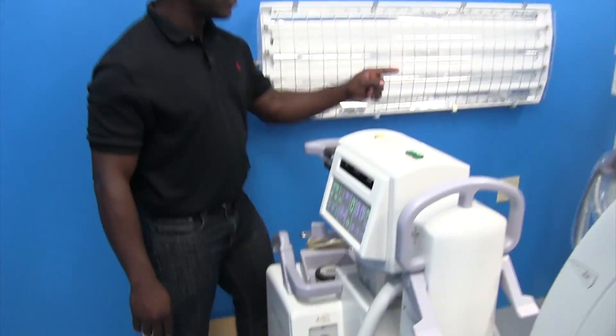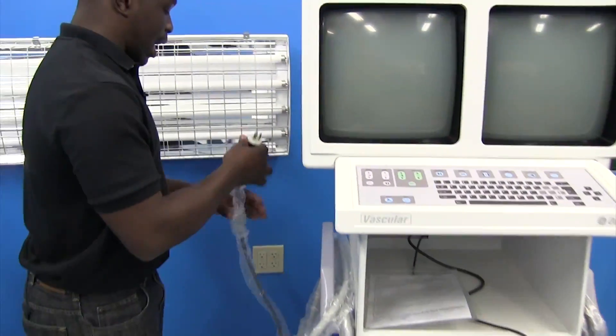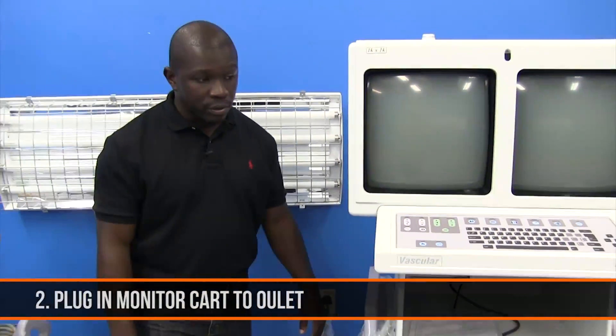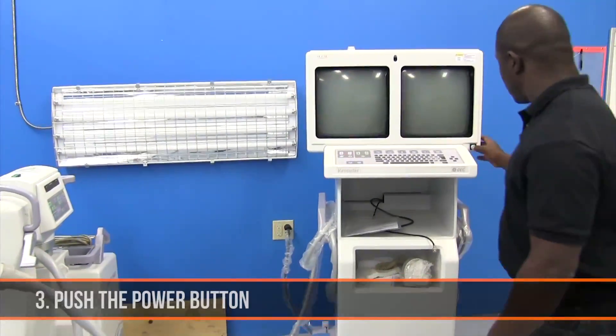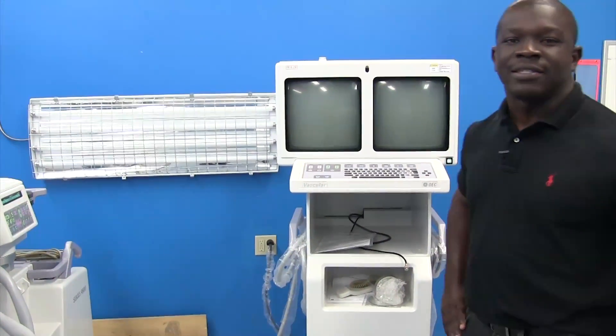you can go back to your monitor card and just plug in to a normal 120 volt outlet and power up your CL. If you have any questions, please feel free to contact us at BlockImaging.com.